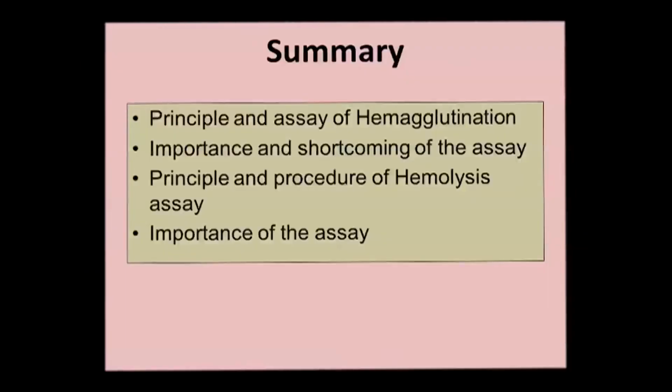It may be an antibody or virus particle, sometimes a bacterial cell, etc. And we also discussed how we can calculate the number of hemagglutination units. Also, a disadvantage of the hemagglutination assay: it tells us about the hemagglutination-causing agents, but it does not tell us about the number of alive and dead viruses present in the sample, because both alive as well as dead give the same amount of hemagglutination reaction. We also discussed the hemolysis assay.